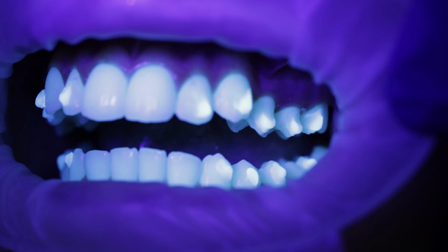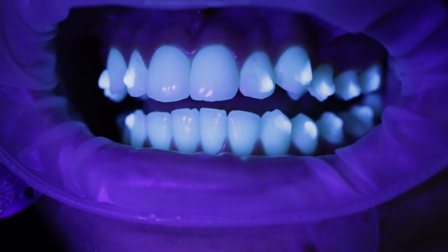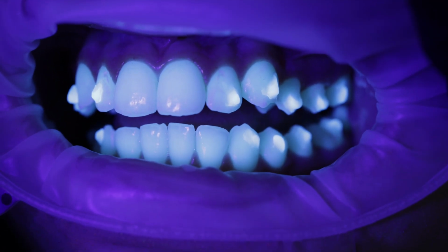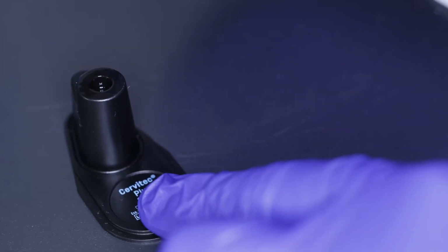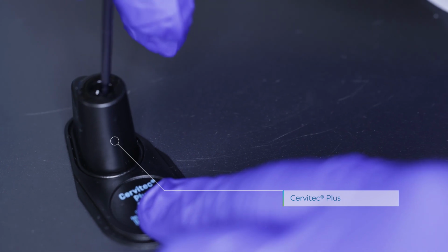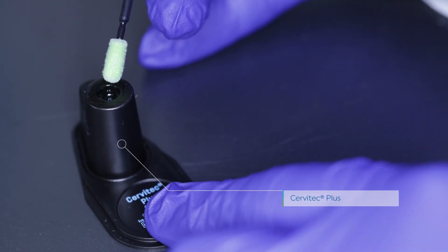And most importantly, it's the best thing about Tetric Evo. So here we're able to see this with Kennedy, and we can light up her mouth, see any excess resin, and yes, there was resin, so we had to go around and polish some more or take a scaler and remove it. Sometimes the doctor has to take a little ET carbide. And then what we're going to do now is we're going to go around every attachment with Cervitec Plus.